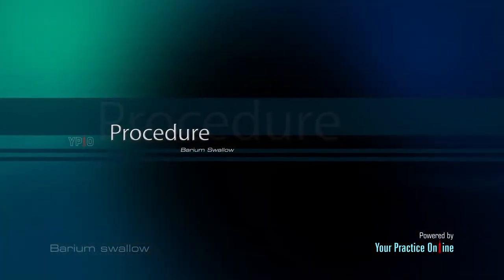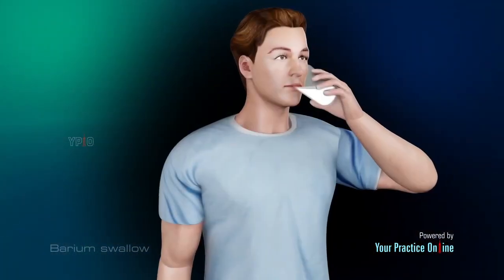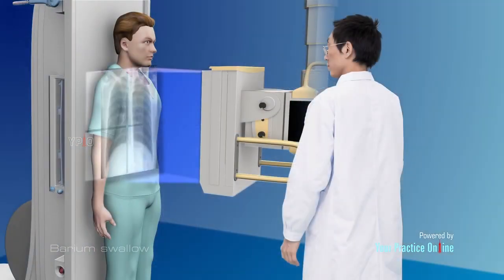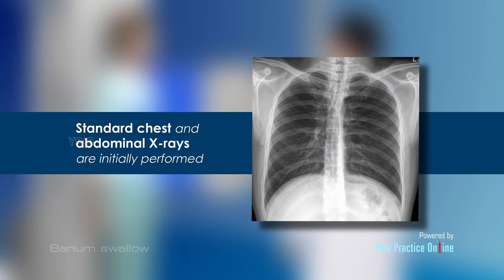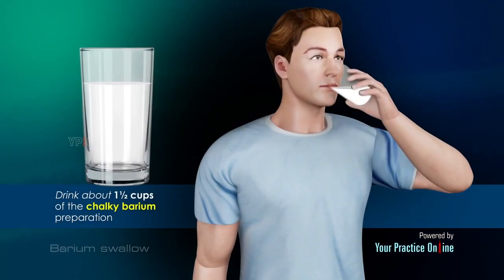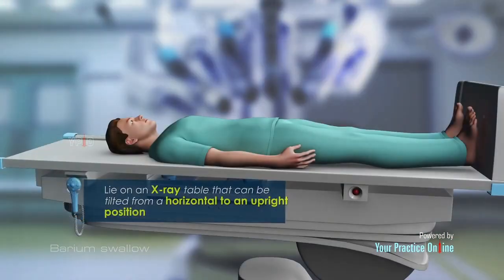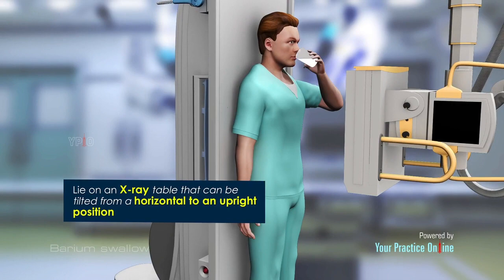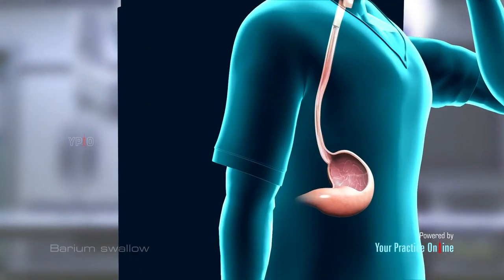Procedure: A barium swallow test is performed in the following manner. Standard chest and abdominal x-rays are initially performed. You will be asked to drink about one and a half cups of the chalky barium preparation. You will lie on an x-ray table that can be tilted from a horizontal to an upright position. X-rays are obtained as you swallow the preparation and while the barium passes through your digestive system.